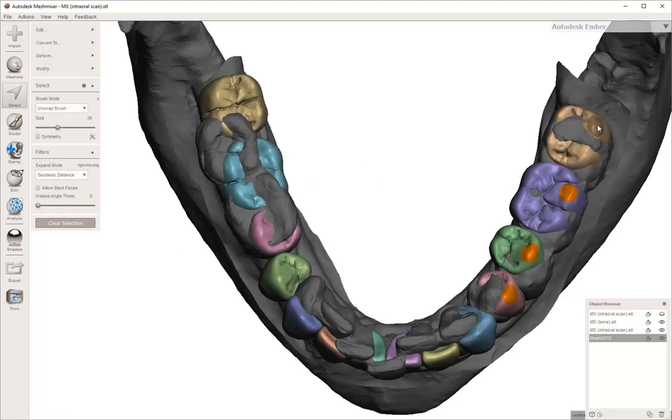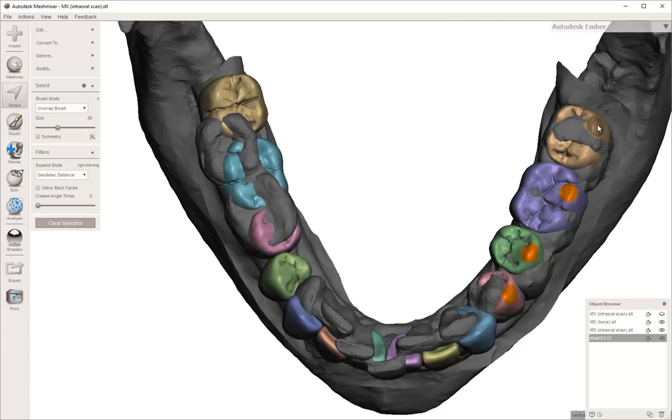Once you get to a point where everything's pretty close, you can then keep those STL files of the individual teeth all as one, but you can start to move the teeth without actually separating them. The way you do this is you can use the select tool to click on the teeth that you want to move.